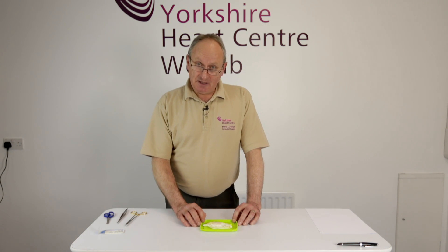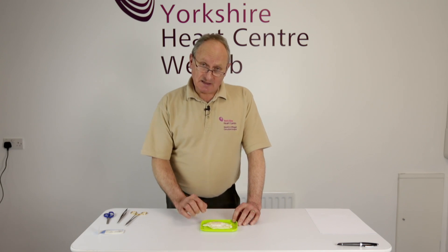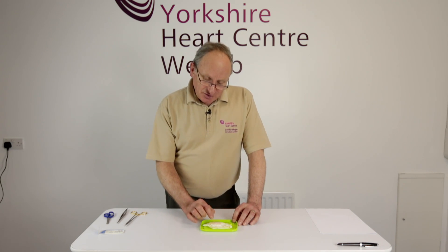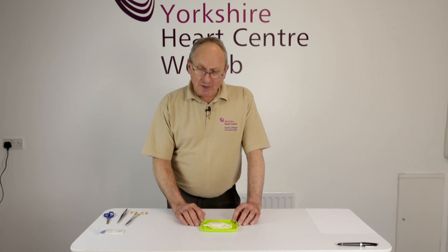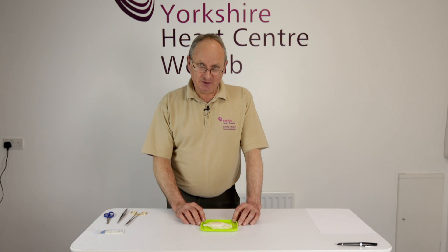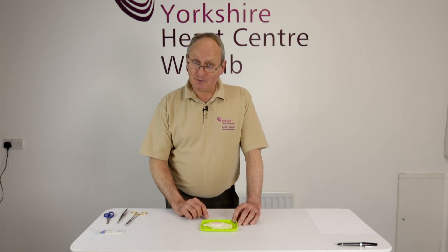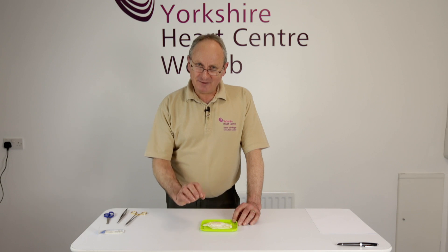That simulates a thin coronary vessel. In this exercise we are going to make an incision in the membrane of the yolk and we are going to practice rotating the needle through the simulated arteriotomy with a clean entry in and a clean entry out without scrambling the yolk.